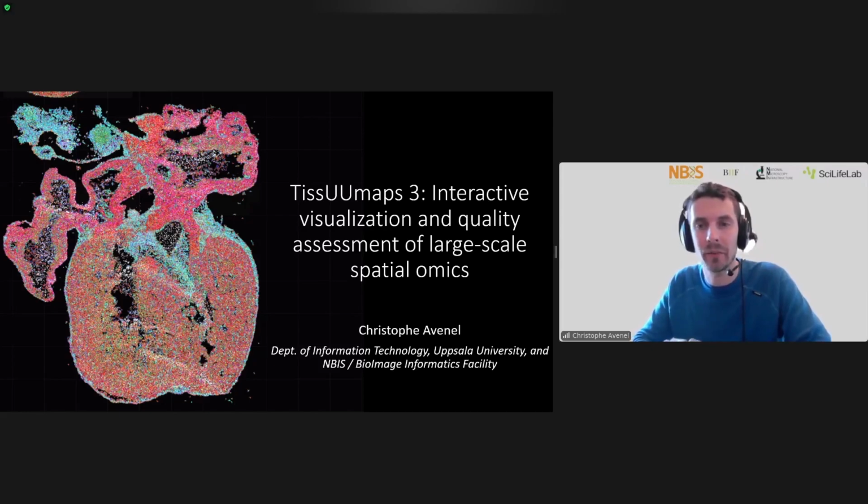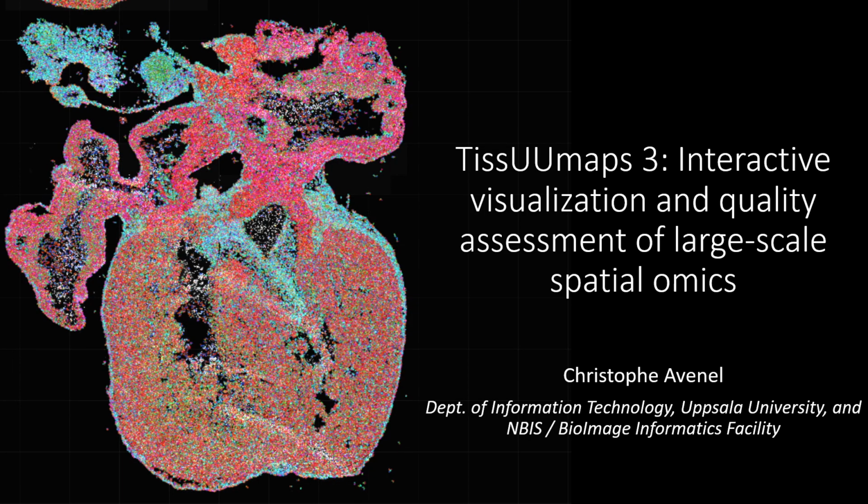And you can display multi-resolution images. You can customize and share your images and points, and you can also integrate it in Jupyter Notebooks, or interface with other tools like Napari or ScanPy in Python, or many other kind of tools. Yes, so that's a short introduction.